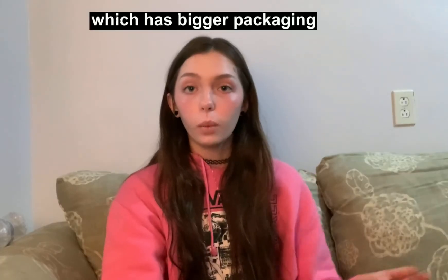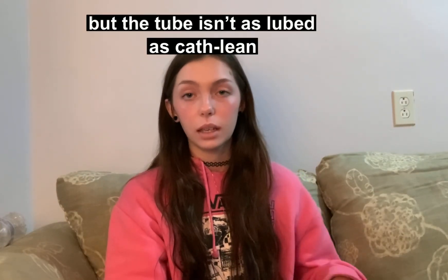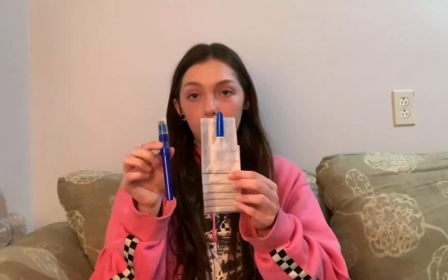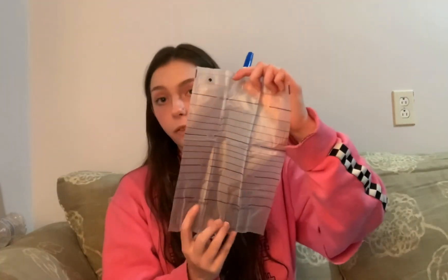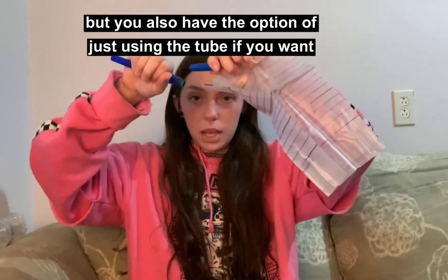Sometimes stuff rips and it's just kind of cheap. I also used Cure Twist. Once you open it, this catheter doesn't come with as many supplies, but it still comes with gloves — these gloves are really huge. It comes with a waterproof pad that is wrapped around the catheter itself. The bag holds up to 1500 milliliters, which I would really hope you wouldn't need, but you do have to assemble this one by taking it out and basically connecting the pieces.